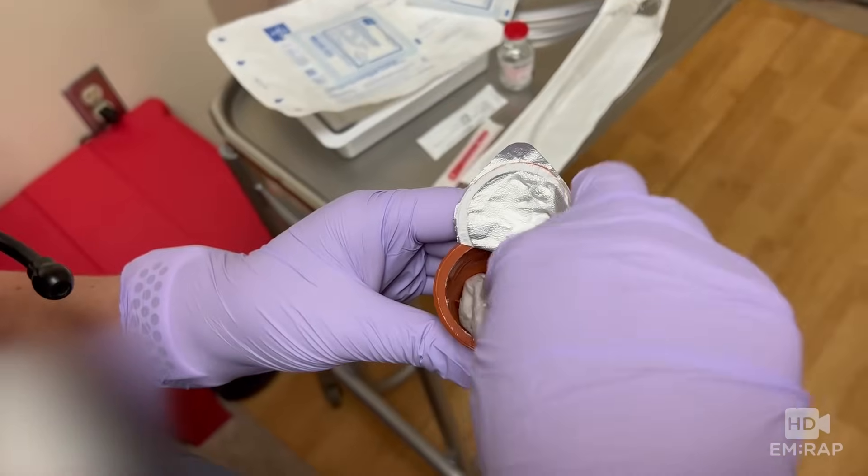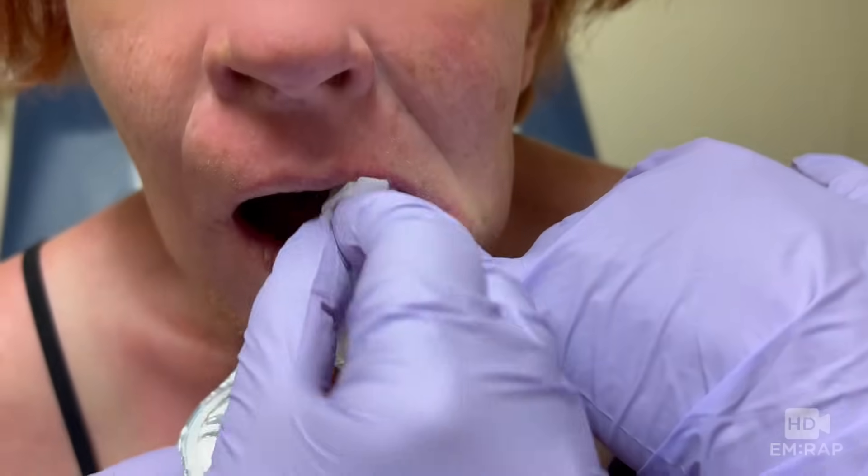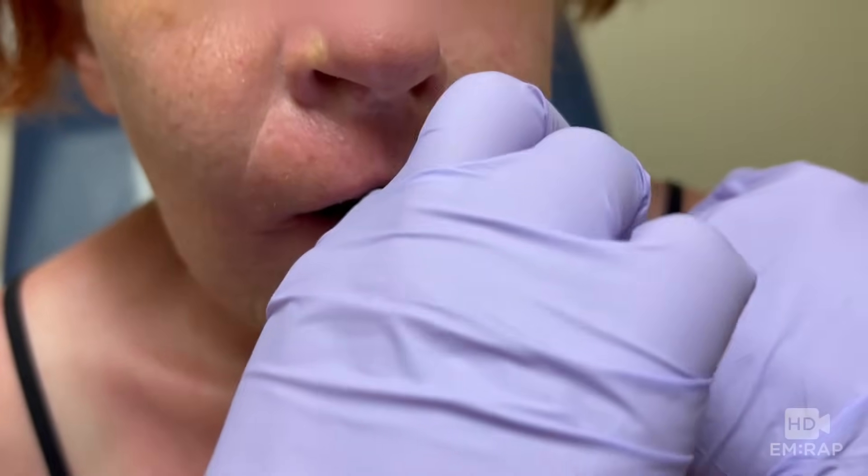First, take the viscous lidocaine and soak it up with a 4x4. Then pack that into the gingiva in the area of the planned injection and incision. Warn the patient it's not going to taste very good, but it is better than feeling the poke.